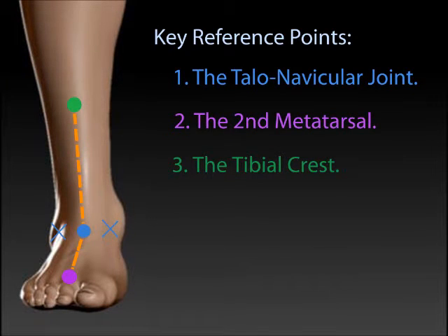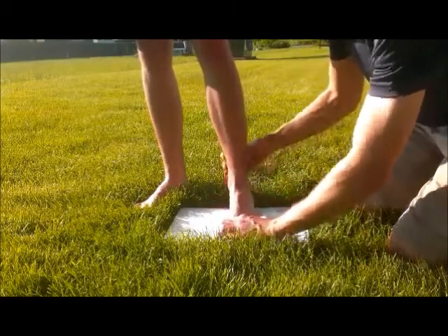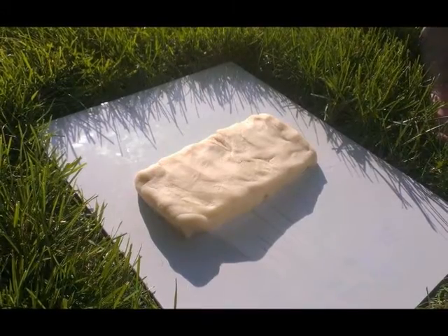Just like any good structure, the weight of the body should be placed directly above the foot. Alright, now it's time for the casting procedure.